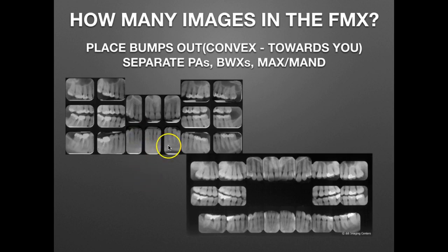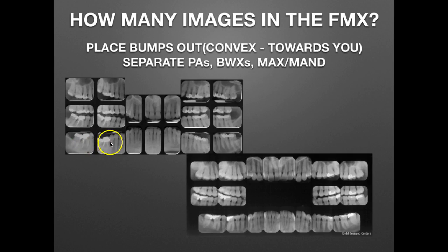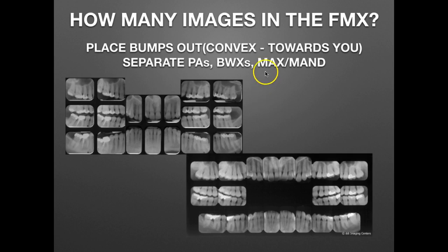Take all of your films — after processing, they all come out in a little pile. You have this pile of film in your hand, you go to a view box, and you place all the bumps out or towards you so the bump is convex. Then you want to separate the periapicals — the PAs for the posteriors and the anteriors — and separate them from the bite wings, so you have those in a separate pile or stack of film.